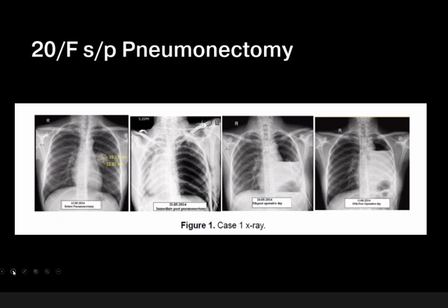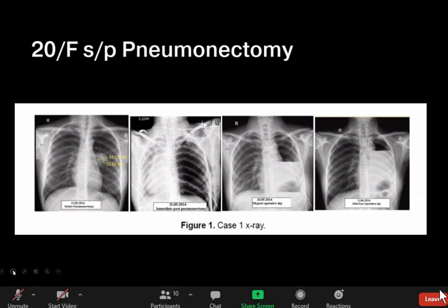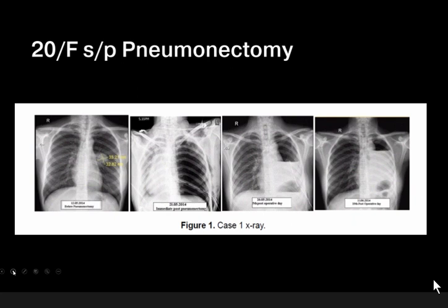Eventually, usually there's also a chest drain on that side to drain the fluid, and eventually the fluid is resorbed or drained, and we would notice that there is opacification of that side also, but this time it's because of the collapse in the lung. If there's no more lung, that side decreases in volume, and then we would notice a shift in the mediastinum and in the trachea towards that side. The maximum shift is usually at 6 to 8 months.